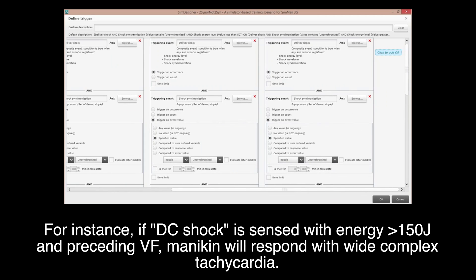For instance, if a DC shock is sensed with energy more than 150 joules and preceding ventricular fibrillation, Medikin will respond with wide complex tachycardia.